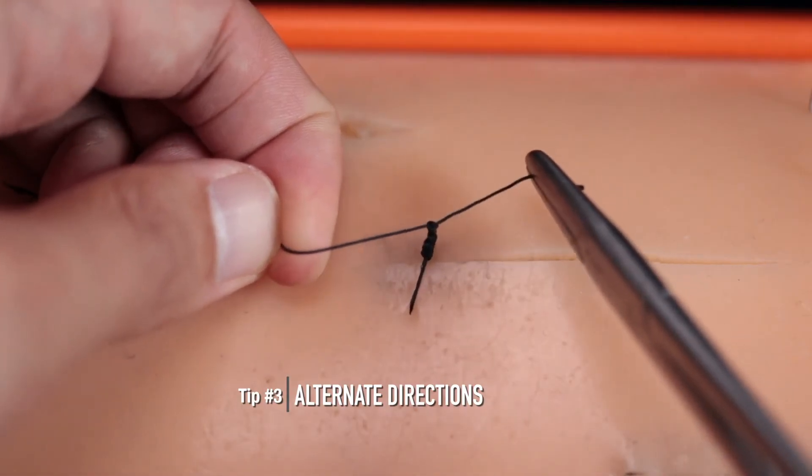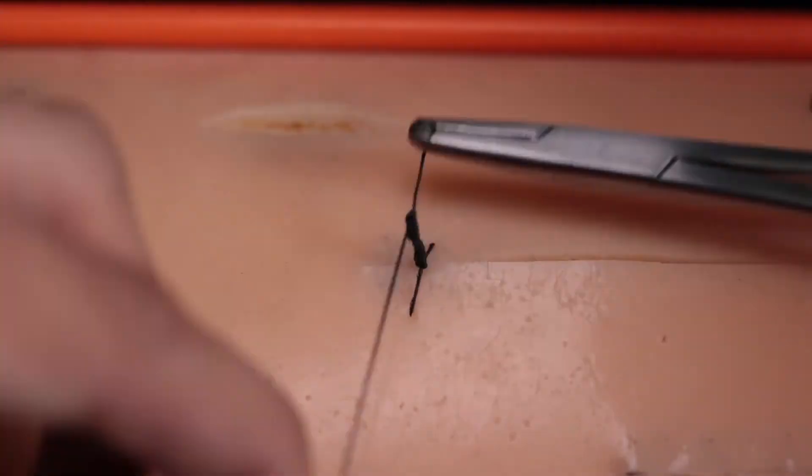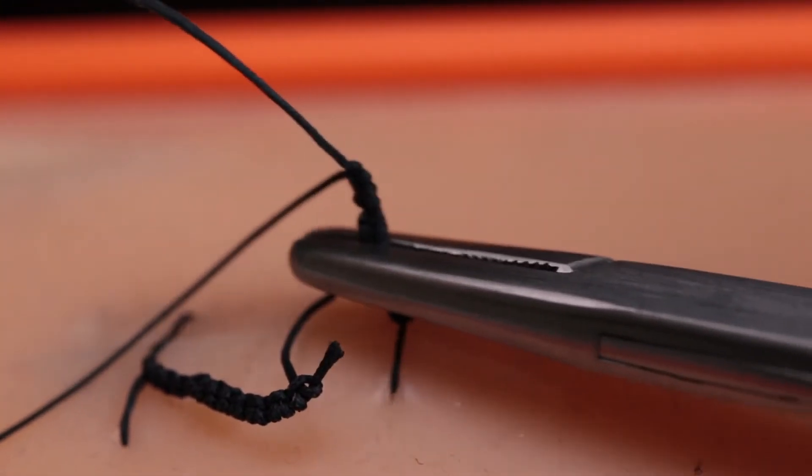Sped up, you can see clearly that I'm pulling on different sides at every throw. And that's it. Keep practicing and move on to hand-tying.